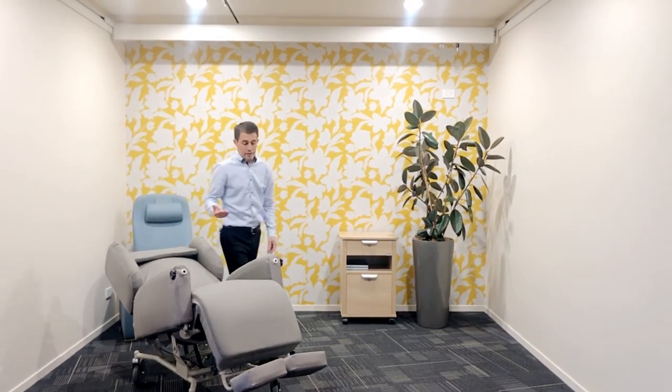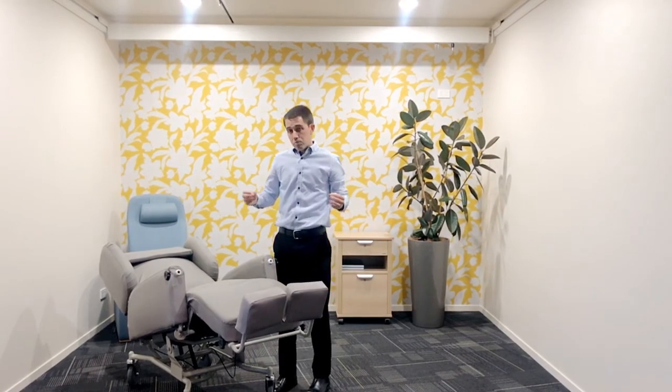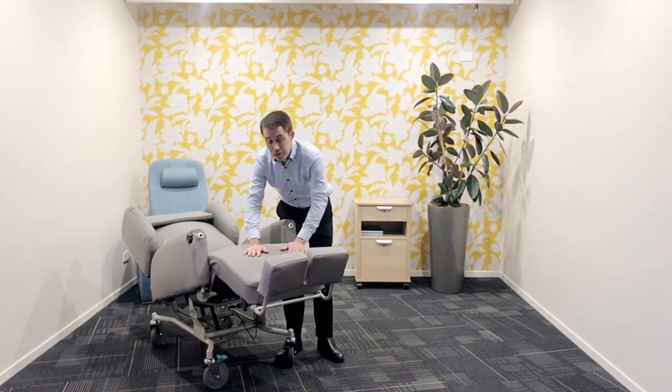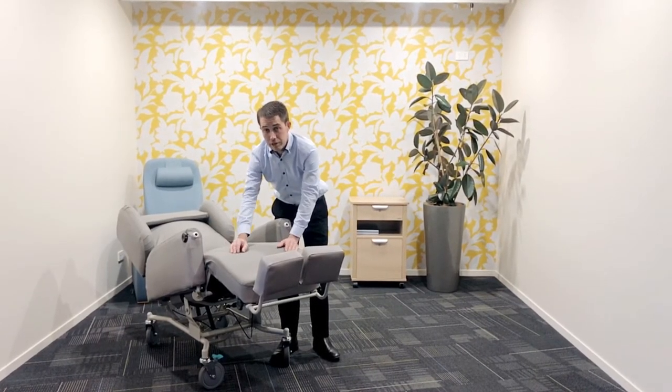Lying right back, and then the elevation of the footrest, means there are multiple positions in the one chair. The cover of this is four-way stretch. This not only aids pressure relief, but makes it very easy to keep this chair clean and aid in infection control.